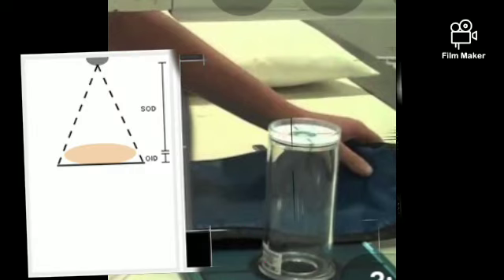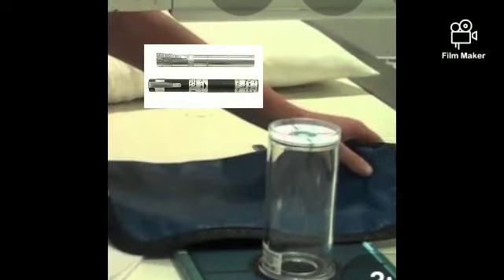So without any further delay, let's move on to the procedure. For this procedure, you require a non-screen film cassette, so you have to remove the intensifying screen. Next, you require the focal spot measuring tool, and then you adjust the height up to 60 cm. No need for 100 cm. Next, you require a pocket dosimeter to measure the dose. Then you can select the kV between 60 and 70 and mAs within the range of 5 to 8.